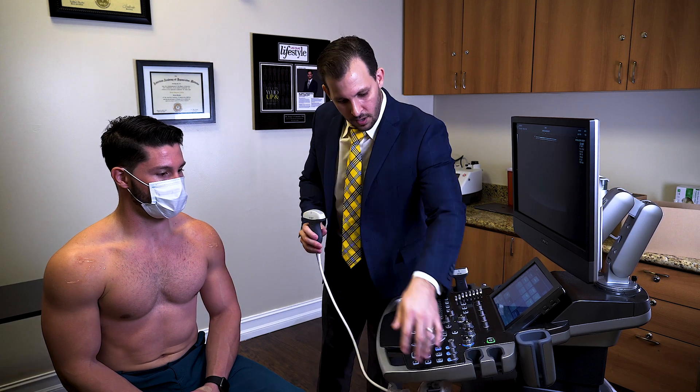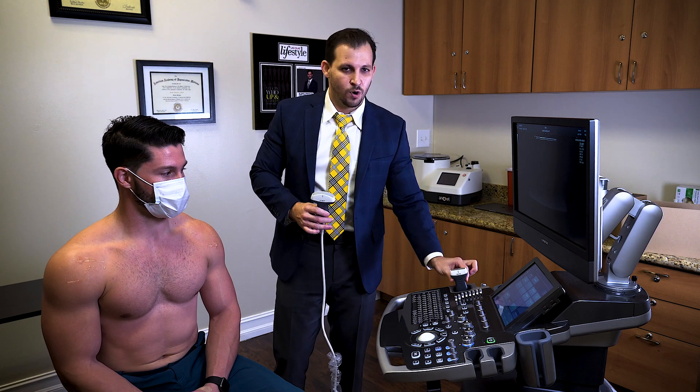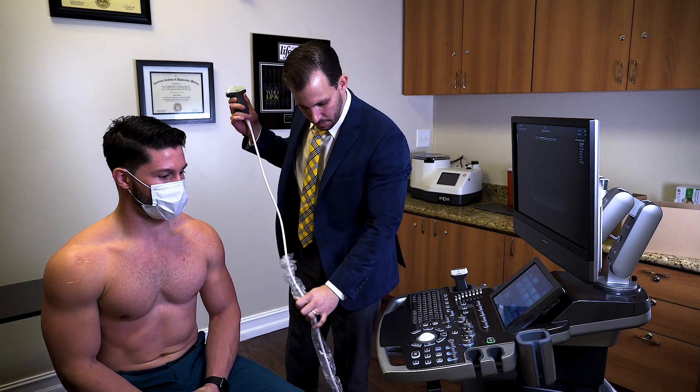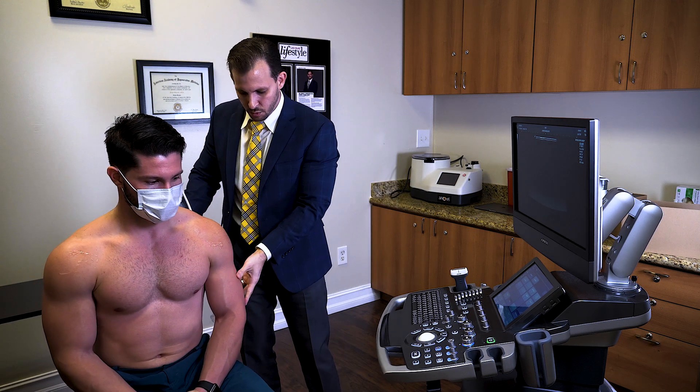Depending on the patient that you have, you could use a linear probe or you could use a curvilinear probe. I have a very muscular patient with me, so I'm going to be using a curvilinear probe. I have already changed my settings to maximize my image.